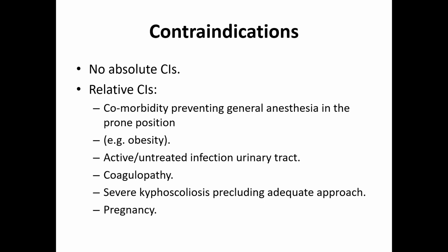to do your stone fragmentation. Relative contraindications are comorbid patients for general anesthesia or local anesthesia, or comorbid patients for prone position, because although these procedures can be done in supine or semi-supine position, they are mostly done in prone position under general or spinal anesthesia.